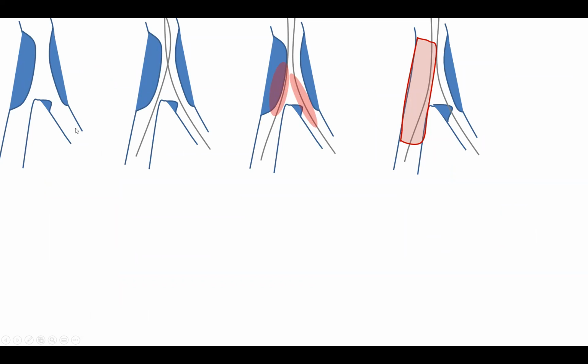Two, you double wire, okay? It's okay to use a polymer wire. You wire the main branch and the side branch. It's okay to use a polymer wire like Whisper in the side branch and jail and stent across it. It used to be said not to do so, but it's okay to put a polymer wire, depending on how difficult it is to wire that bifurcation.